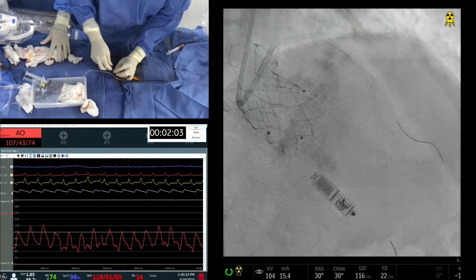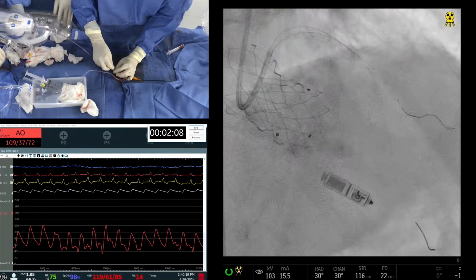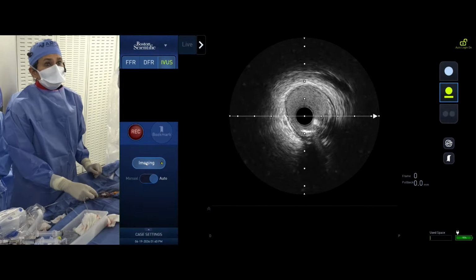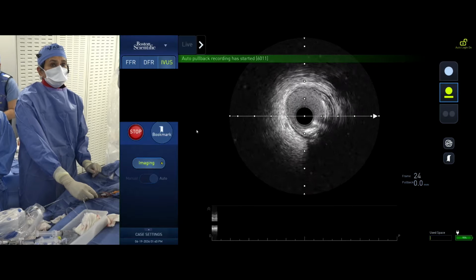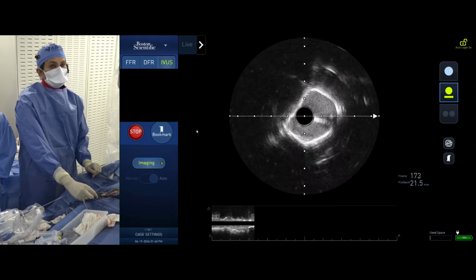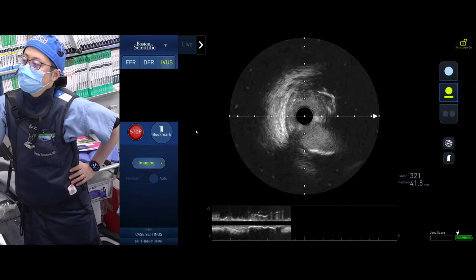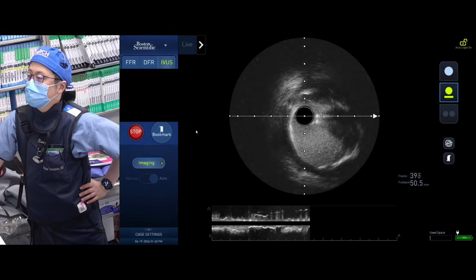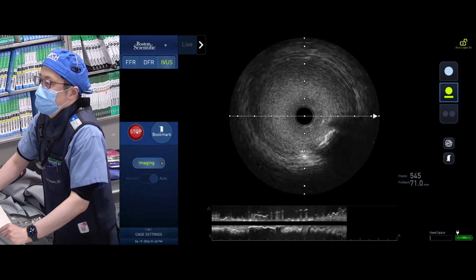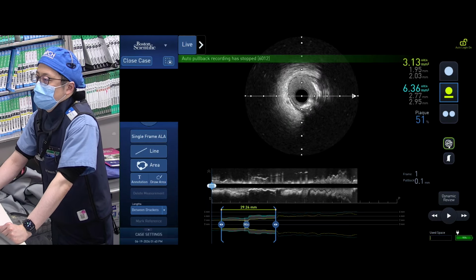We go IVUS. Okay, good. Whatever it takes. Come closer. This is the IVUS of the diagonal now, to see what lithotripsy has done. Okay, start pullback. It's coming. It's all still there. Looks like a much bigger lumen. Come to the nodule part in the left main. I think you have a much better result. IVUS did not jump, and you have a much better bifurcation that you're going to show us.